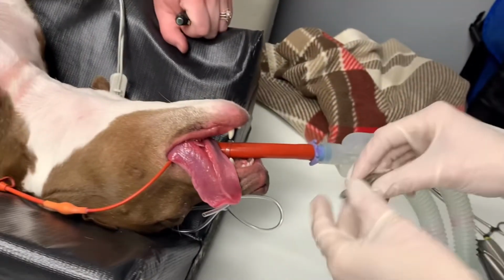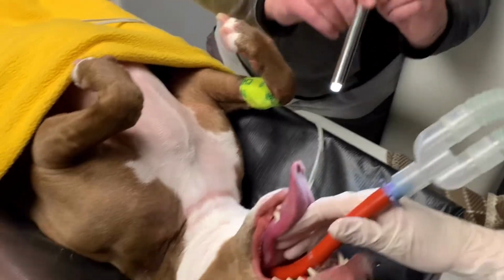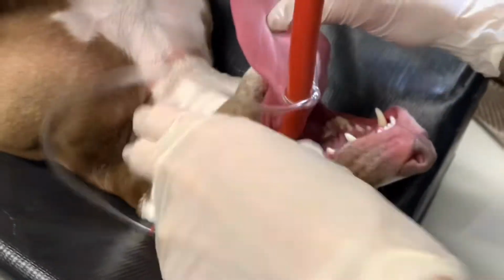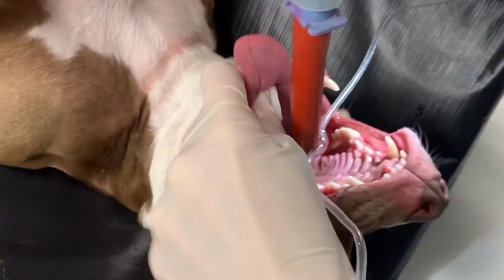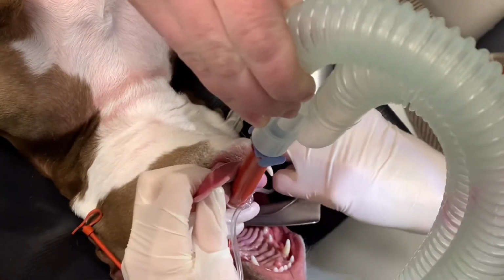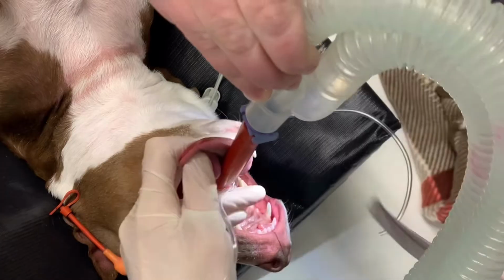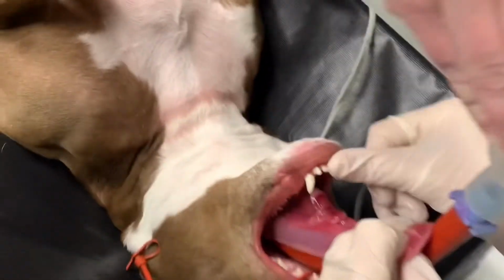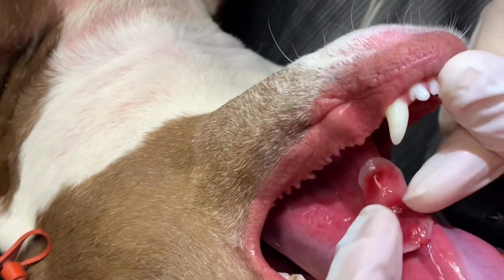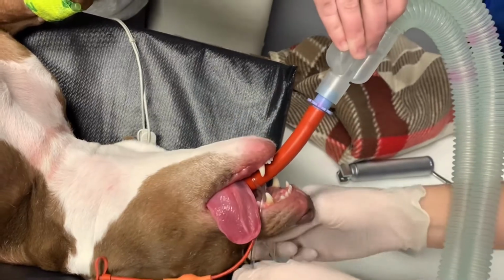So we're also going to see if we can get back in there again. I'm going to untie this tube a little bit. Thank you, Rebecca. And we've also got our laryngoscope to see if we can find anything else. Kind of a weird angle. Doesn't look like there's anything else in there. Okay. Well, you can see it's better here, in the base of the tongue. This string was caught around the tongue, so she couldn't swallow it, and it was just irritating the bottom of her tongue.